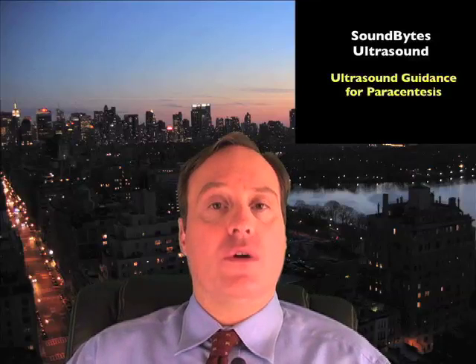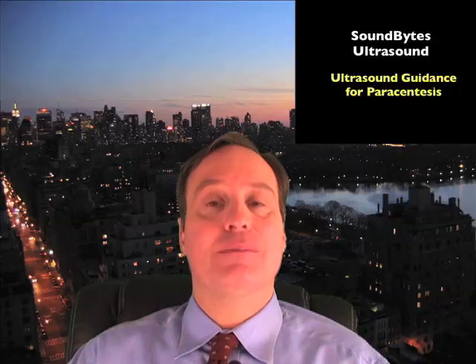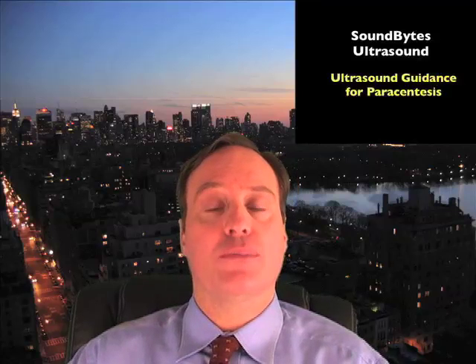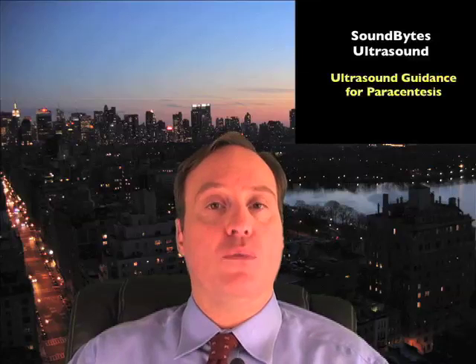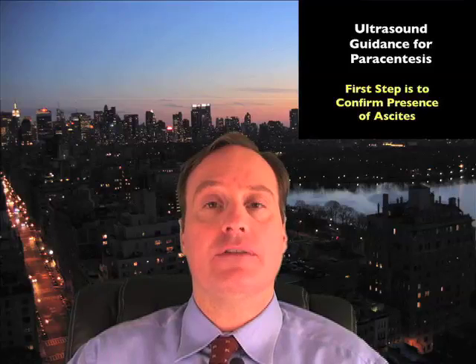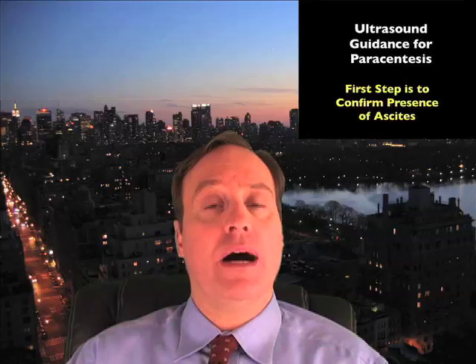In today's module, we're going to focus specifically on the use of bedside ultrasound for the paracentesis procedure. The use of bedside ultrasound for paracentesis can actually lower your complication rate and allow you to know who is a better candidate for the actual procedure. Step number one when deciding if a paracentesis procedure is necessary is to determine if the patient actually has ascites and if there are significant areas of fluid pockets amenable to a drainage procedure.